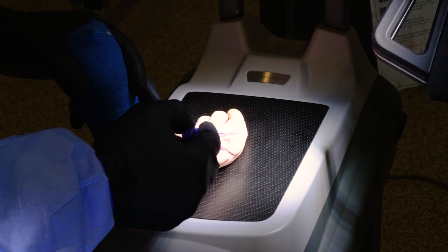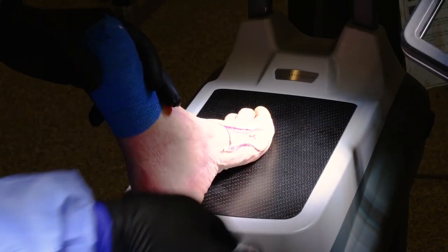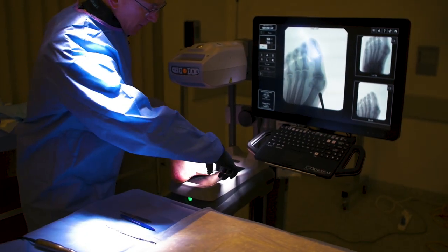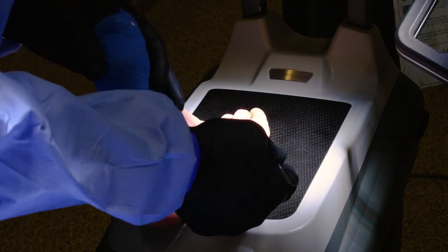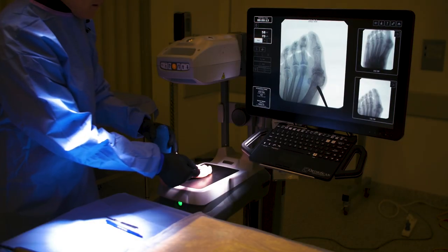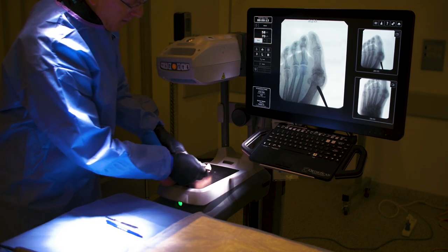There's a dorsal medial cutaneous nerve that comes across in this area, so I'm not cutting down to bone directly. I'm going to make a small incision here — big enough that I'm not burning the skin. You can use a beaver blade or a regular blade; I tend to use regular blades because we have more of them. I then spread down carefully given the nerve, take a freer, and I'm creating a working space below my EHL.